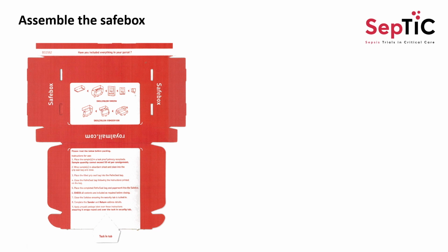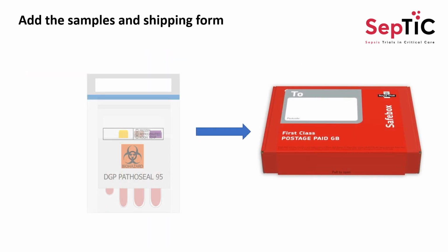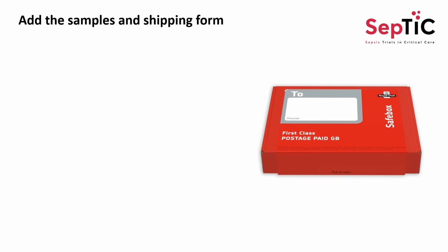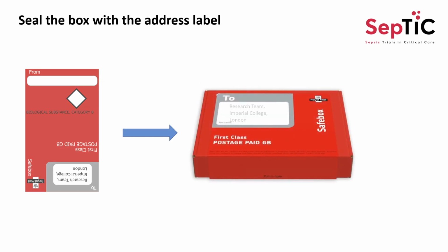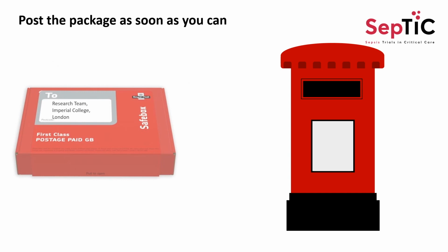Once the form has been completed, the safe box can be assembled following the instructions on the back. This can then be filled with the samples within their protective plastic bags, which should be ensured are sealed, and the sample shipment form. When the box has been filled, you can take the sample shipment label, which will be pre-labelled with our destination address, but you need to complete your own address in the white box at the top. Once this is done, this label can be used to seal the safe box. Once the safe box is full and sealed, it can be taken to your local post box where it should be posted as soon as possible.